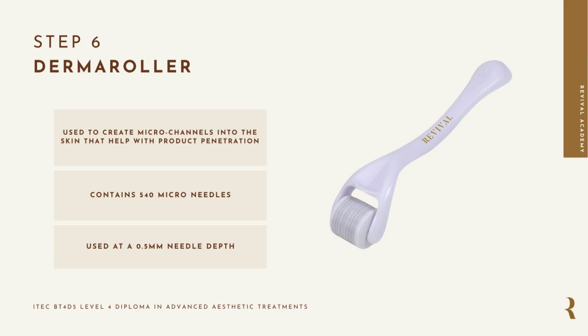Now you can move on to the next step, which is using the Revival dermal roller with the chemical peel. The dermal roller consists of 540 microneedles, and they actually open up microchannels into the skin that allow the chemical peel to penetrate into the deeper layers of the skin. In comparison to only topically applying a chemical peel, using it in combination with the dermal roller, the results are completely optimized. For this step, you are going to need a 0.5mm dermal roller.